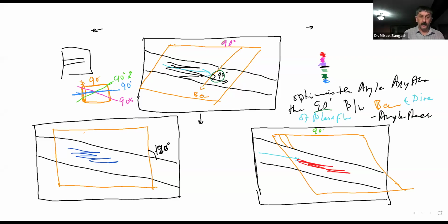So the magical trick of how to put color into the color map is to steer the angle to an optimal angle, which is any angle but 90 degrees. Did you guys get that? So with your box here, what previously was an optimal angle is now not an optimal angle.